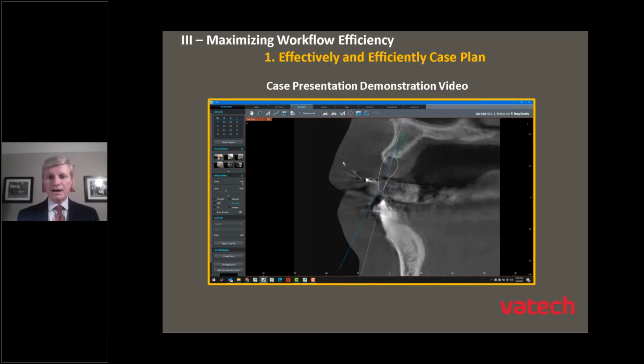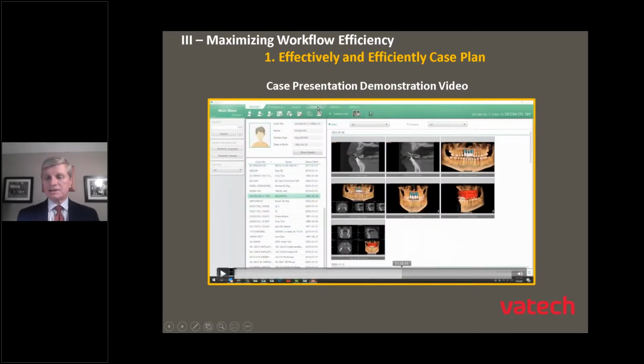All these images are now being saved, not only on my computer, but they're also being saved on every computer that has the EasyDent software installed on it, including the computers perhaps in your exam room and in your treatment coordinator room or your consult room. So now what I have the ability to do is take these snapshots, right?